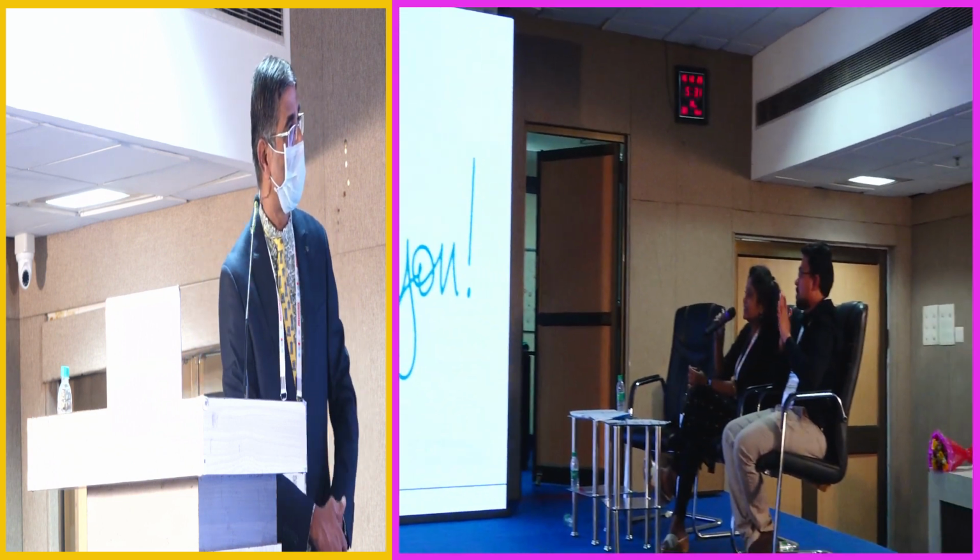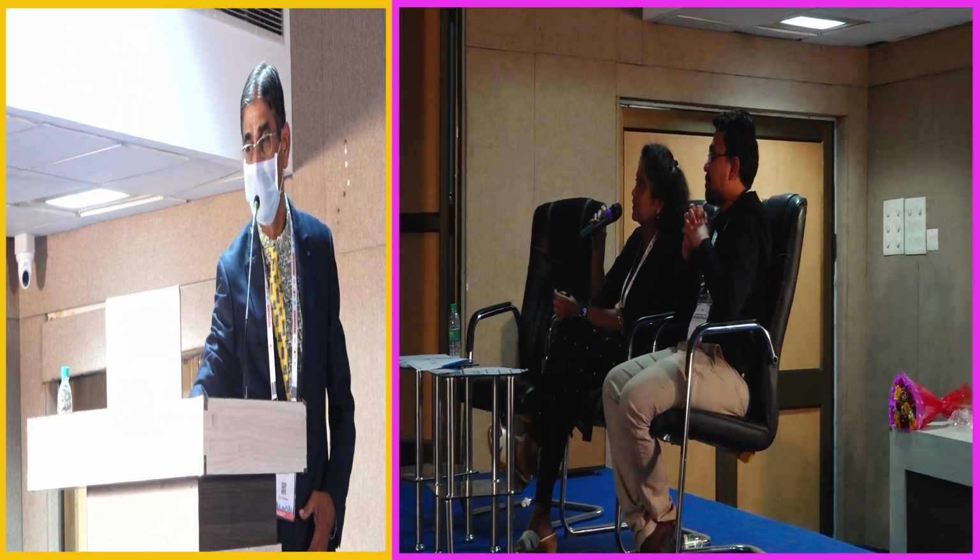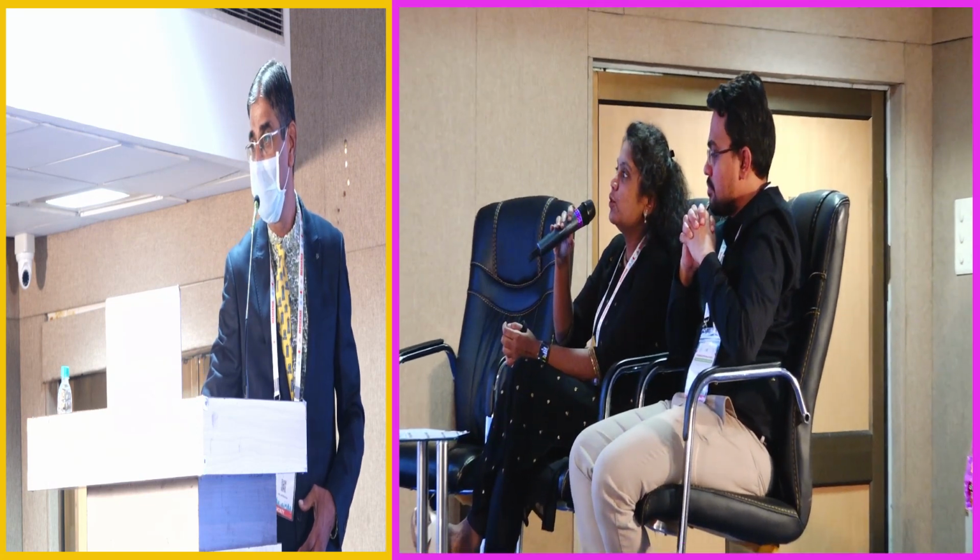So thank you for that excellent talk on technical aspects coupled with the clinical picture. Do you have any key messages for our dialysis technicians to ensure the maintenance and safety of an HDF machine in the unit? Only thing I would say is, they should disinfect the machine, of course it is automatic, nobody can stop or bypass it. Even if they stop and put it to rinse, the machine will not allow it to go into the conductivity test, it will definitely fail.